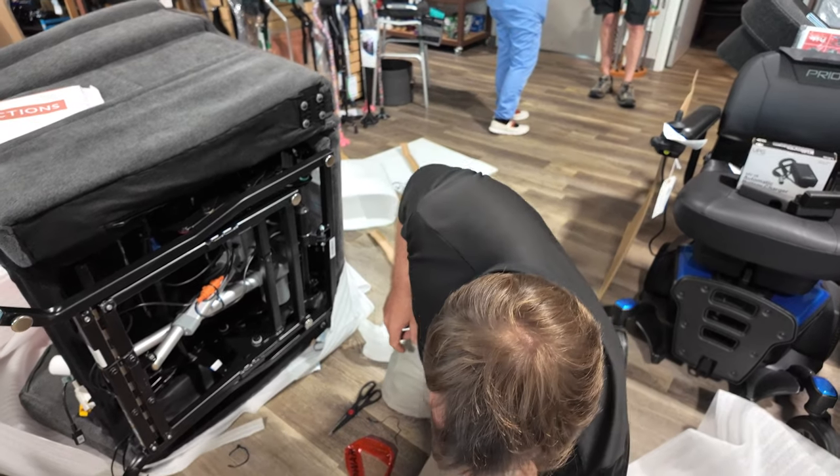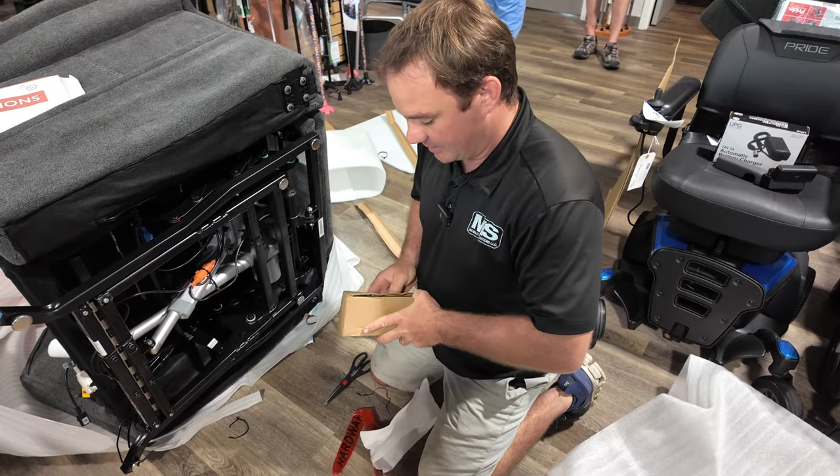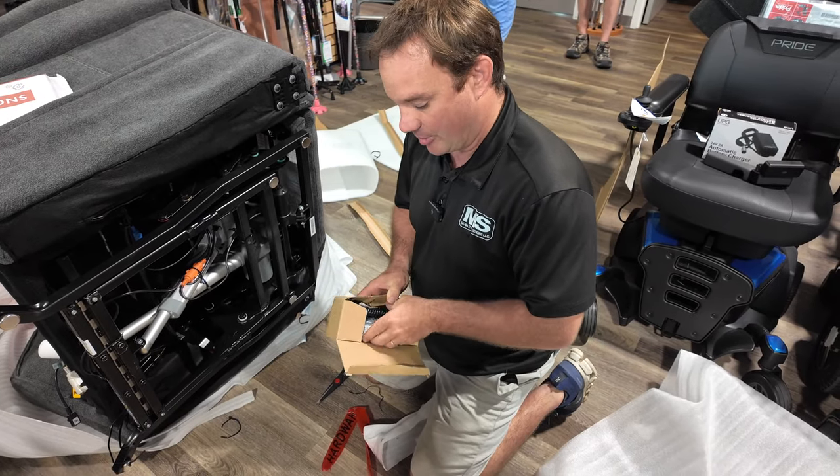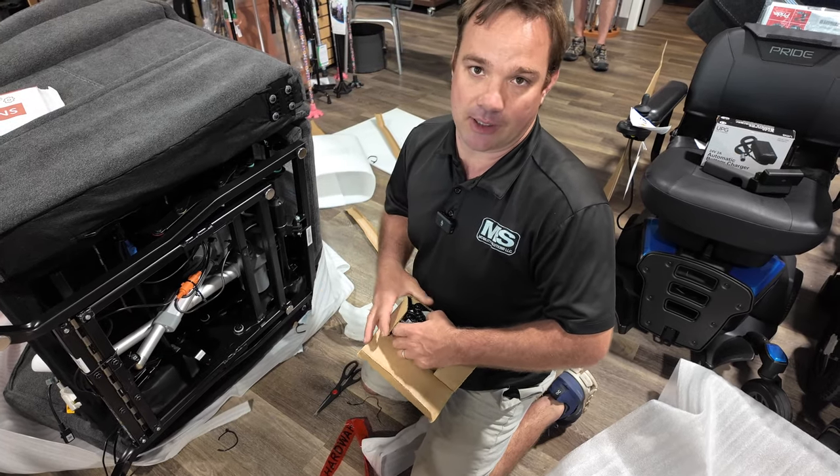Everything's pretty simple — plug and play. The hardest part is probably getting it out of the box and moving it to where you need it, so please have someone to help you do that.